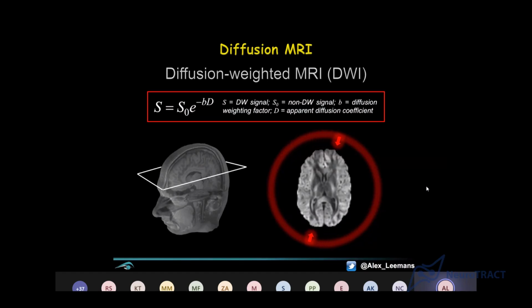And this B value, actually fun side story, B, why B? Well, this diffusion weighting factor was proposed as a condensed formulation of all these gradient properties, like how big is the gradient, how long do you activate this gradient, and what's the time difference, the time between the onset of the 2 diffusion gradients, because you apply a gradient, then you do the 180 flip, and then you apply the gradient again.